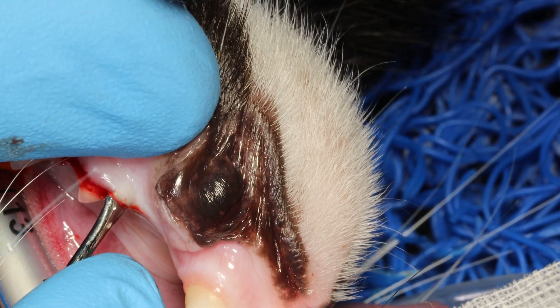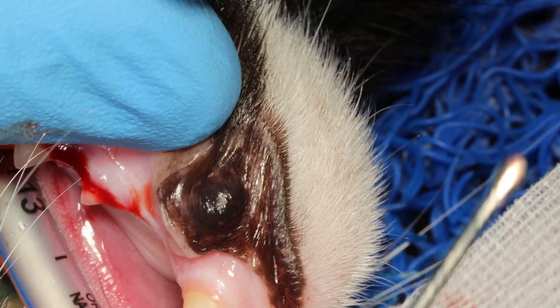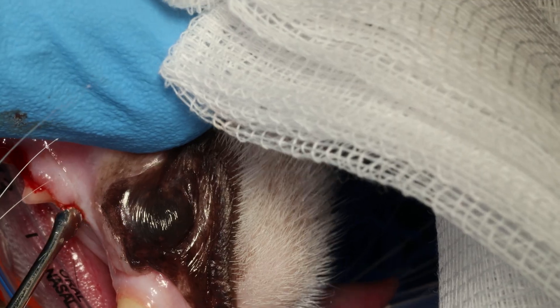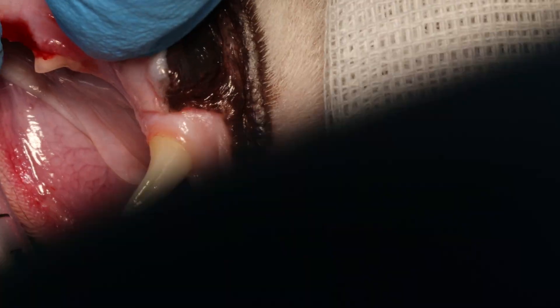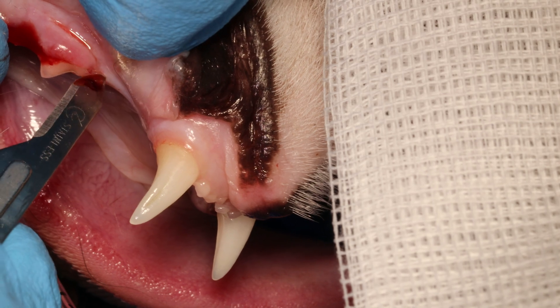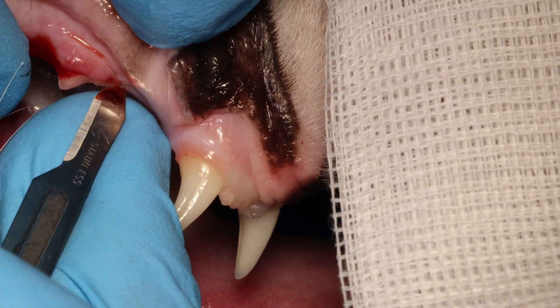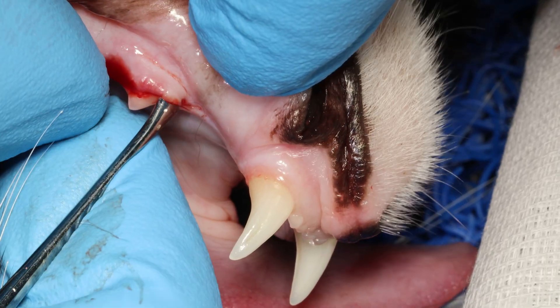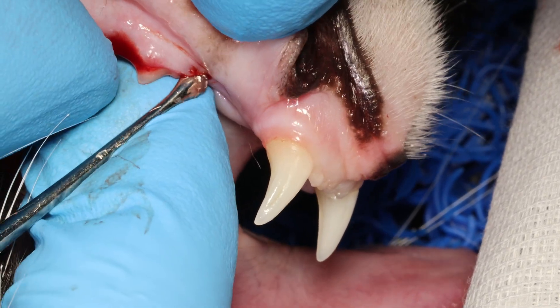Here I am afraid that I may tear. There is a tiny little tear just happening here, so I don't want to continue trying to release it because I am going to tear the flap. Instead I will get my scalpel and just extend it a little bit extra.